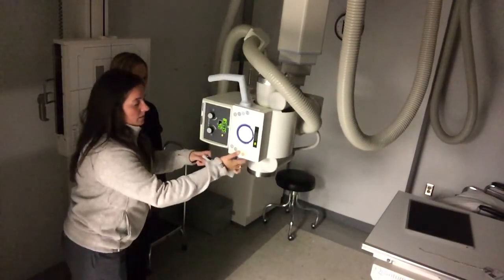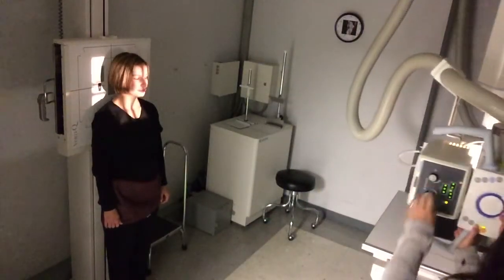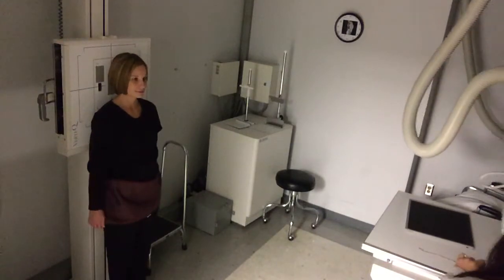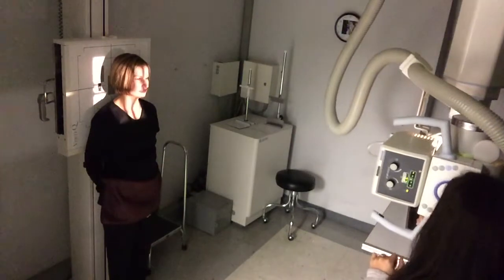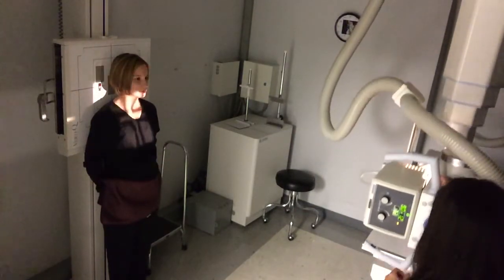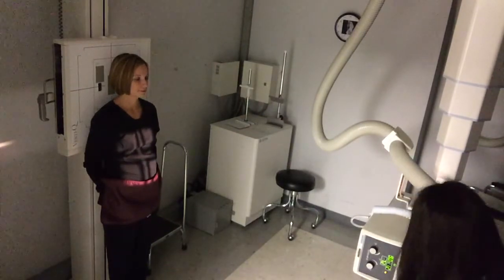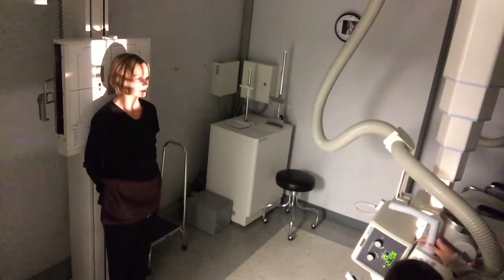Now for the next 2, I'm going to back on up to 72 SID. Again, trying not to blind my patient here. Alright, and I'm just going to start with the AP projection. Since her back is already up against the board, that means she doesn't have to move. I'm going to angle my tube up 15 degrees here.